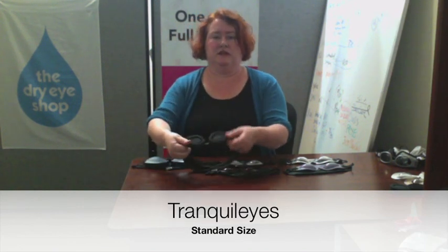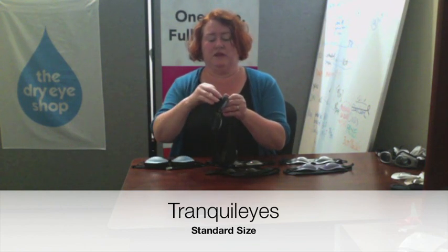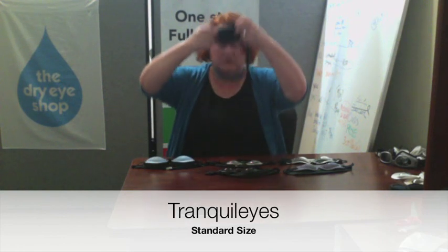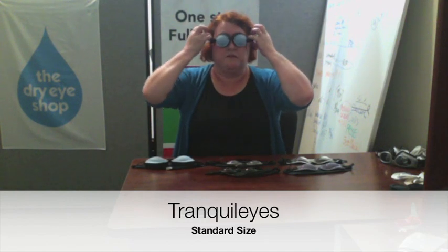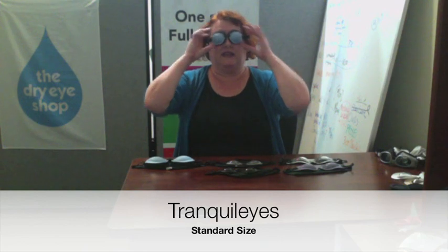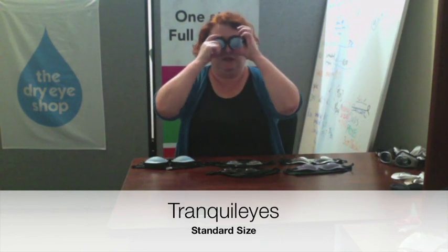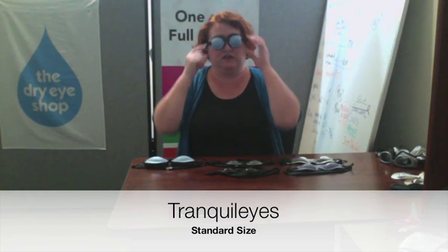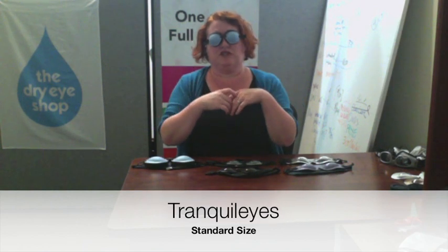So this is the one that's got the moisture pads. Take them out, get them wet, squeeze them out, put them back in, adjust your strap. Pop it on, try to untangle your hair. Sizing is kind of small to medium. The cushions form a seal around your orbit. It's pretty forgiving on fit because of the width of those cushions. And then the pads, of course, are just maxing out the moisture in there.